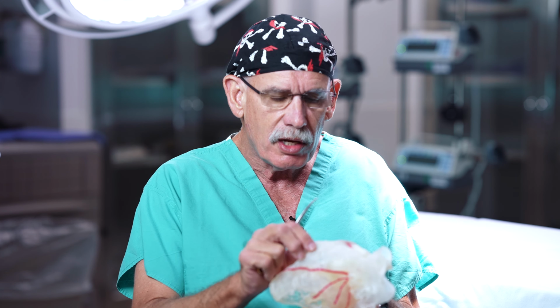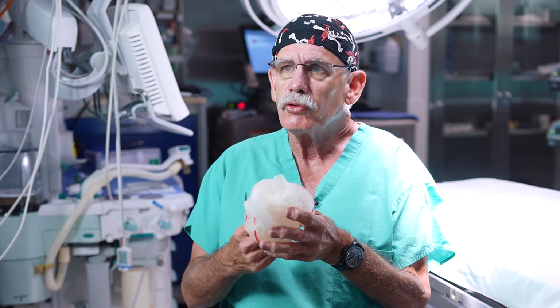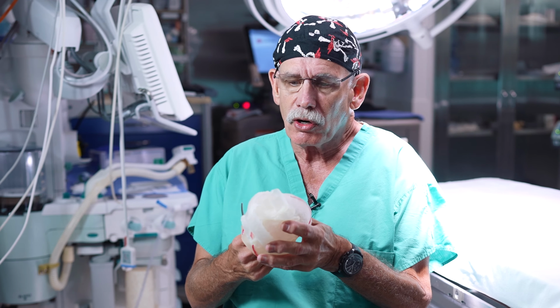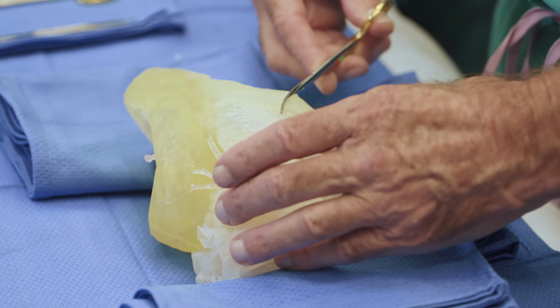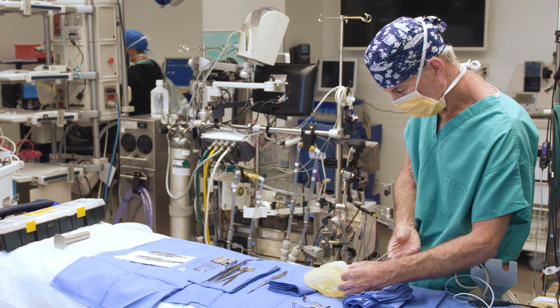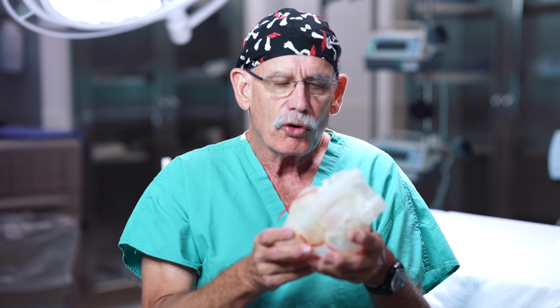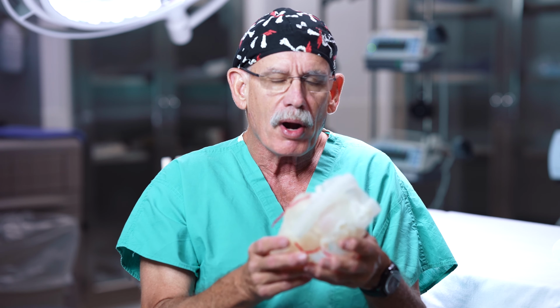And the software and the digital anatomy models enable thin things to feel like thin things and thick things, like septums in the hearts, to not be rock solid, but to be able to simulate actual material that we can cut and sew, that we can take our scissors, that we can take suture material and practice operations. It's an enormously powerful tool for surgical planning and surgical practice.